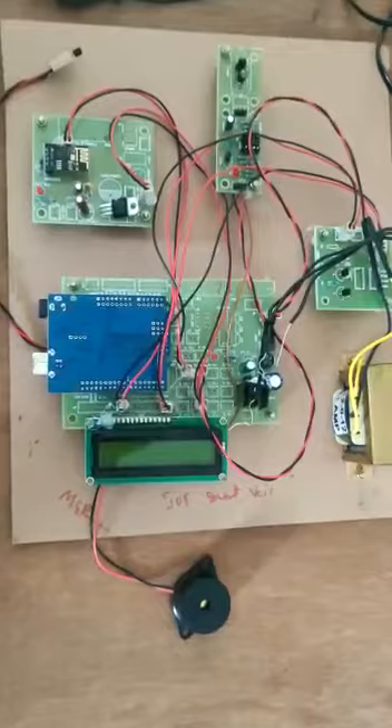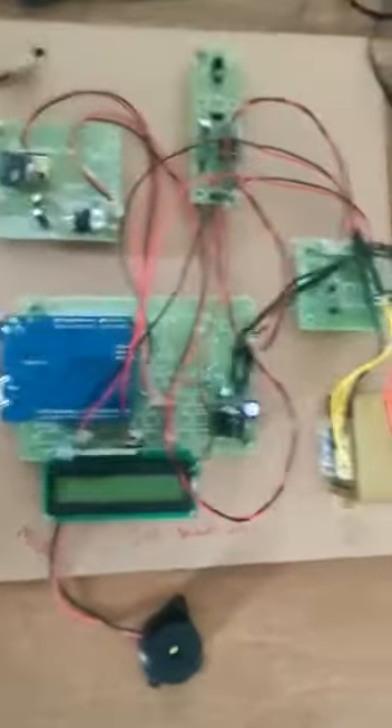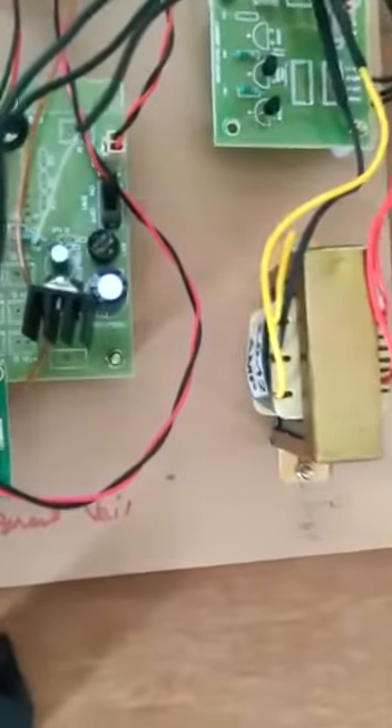The outputs are buzzer, LCD, and power supply. This is the power supply. From the switchboard, we get 230 volts AC supply.